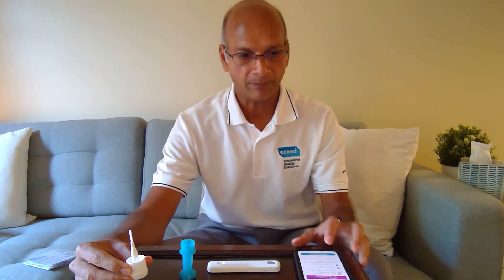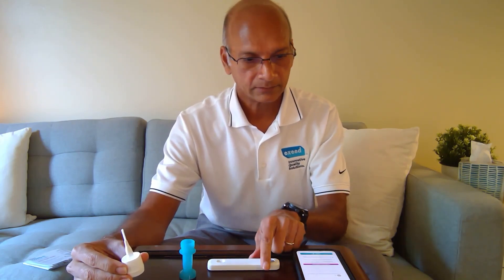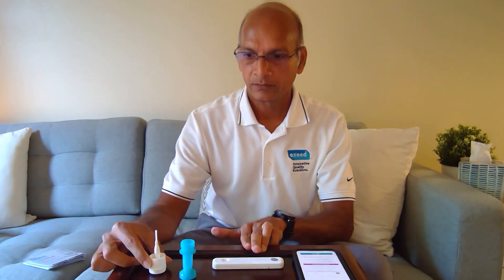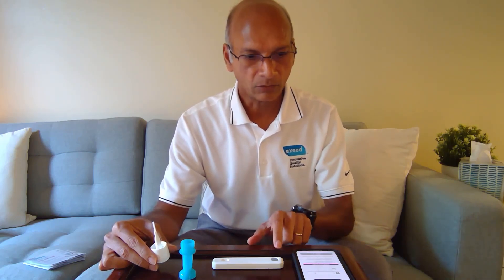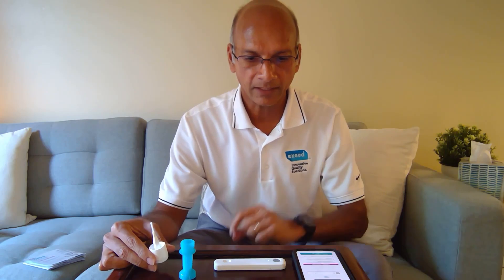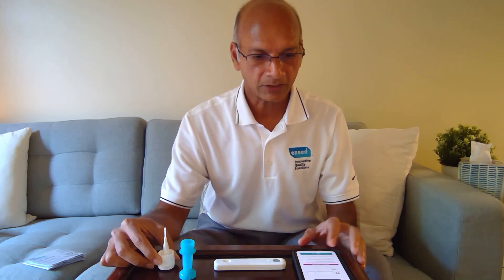Now I'm going to hit 'Start Instructions' on my app. It says turn on the analyzer. We're going to press that button. One thing is, if a phone call comes during the test, you have to keep this on — answer on speaker, do not disconnect it. So we're going to press once. The green light is flashing and there's a Bluetooth icon next to it. Now, place the analyzer within three inches of the phone. Hold down the analyzer button until the light starts to flash — yes, it is flashing. Now it is solid green and I get a check mark: connected. So everything is connected.